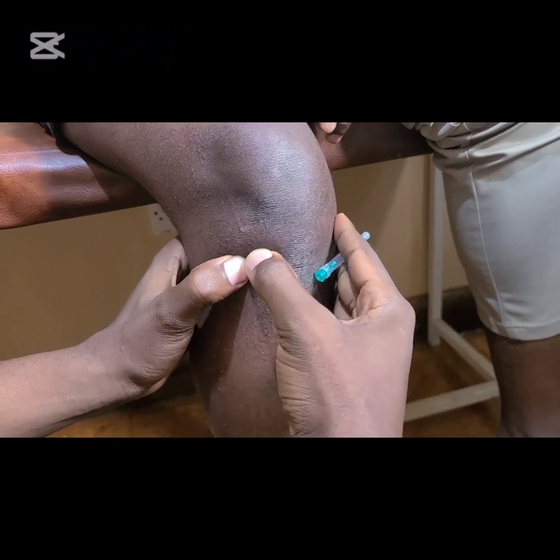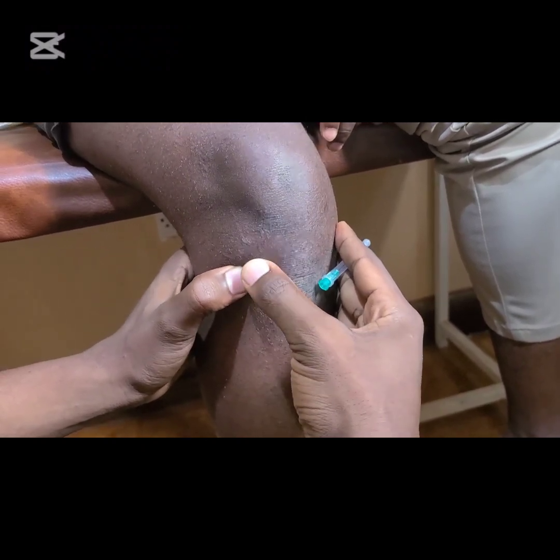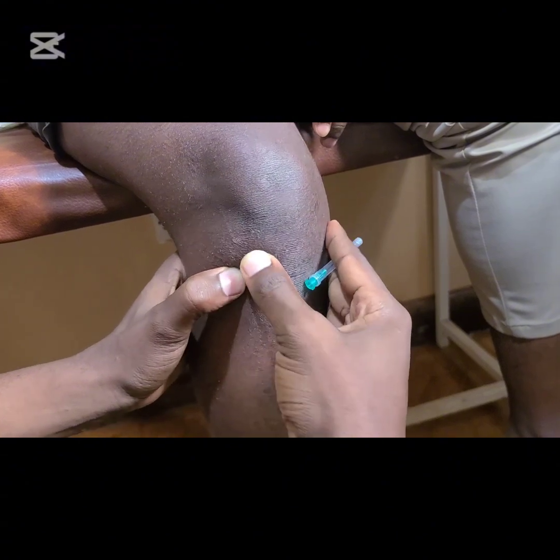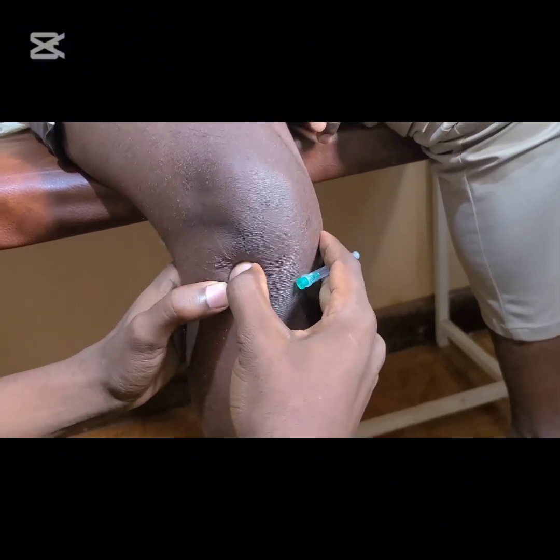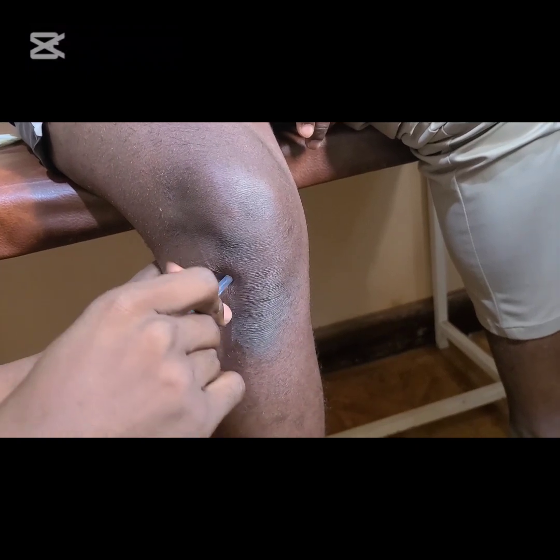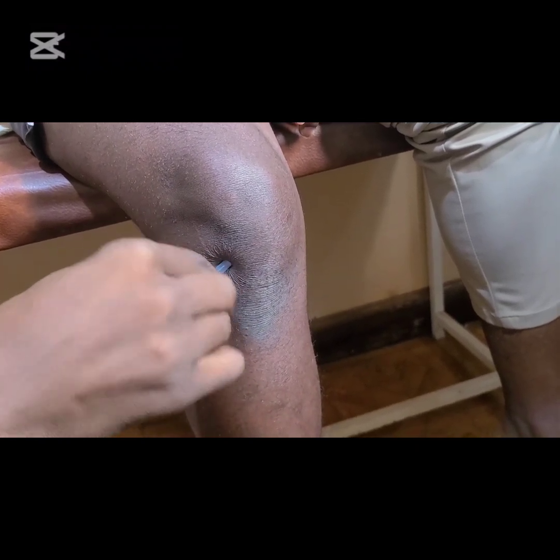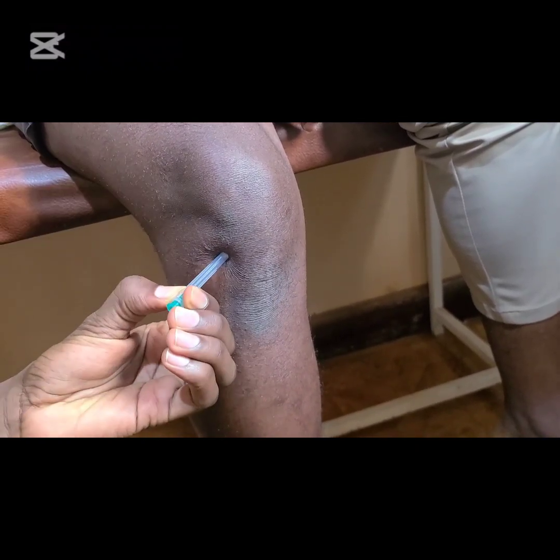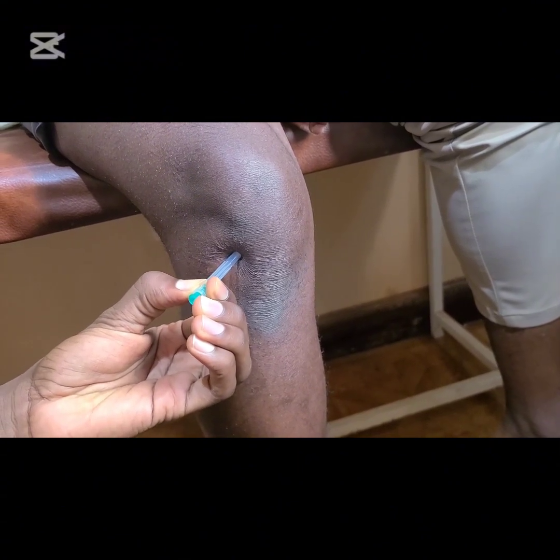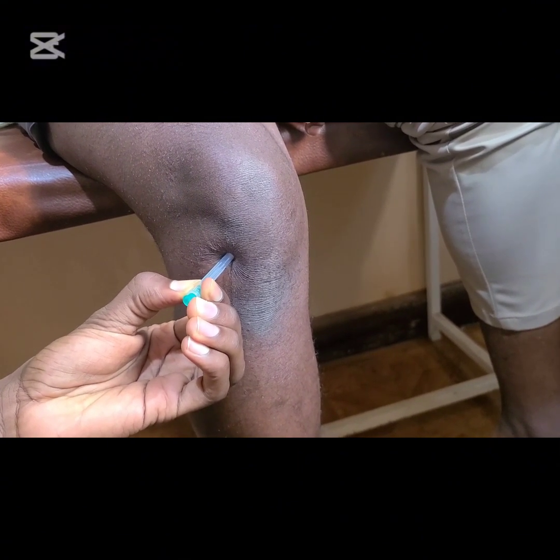Then after that, we shall look for the surface markings which will guide us within our joint. And in this case, we are using the knee. So for the knee, we usually use the inferior pole of the patella, the lateral aspect of the tibial plateau with the joint line and the patellar ligament. So just lateral to the patellar ligament is where we have a depression, and it's where you are seeing being marked.